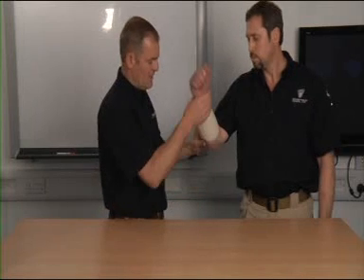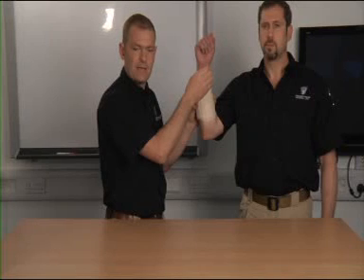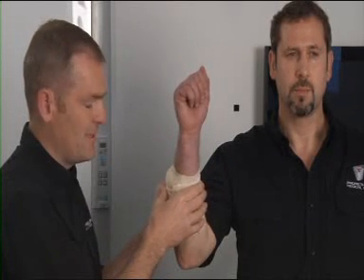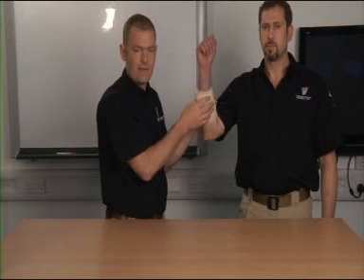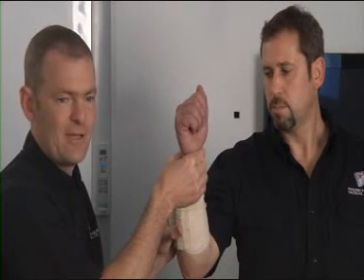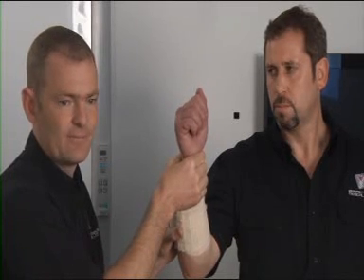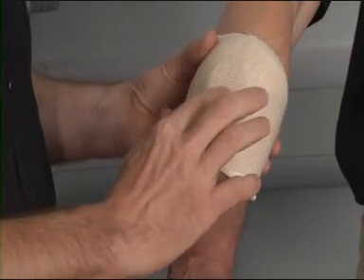Having done this on a limb injury, I would usually elevate the limb, and of course I do want to be careful and think about perfusion of blood beyond — distal to — the wound, because we can apply this very, very tightly. The important thing we're trying to do is to stop the bleeding, and for that we sometimes need as much pressure as possible, but it doesn't mean we shouldn't be reassessing the casualty subsequently to make sure, for example, that the patient still has a radial pulse and that we haven't applied the bandage as tight as an arterial tourniquet.